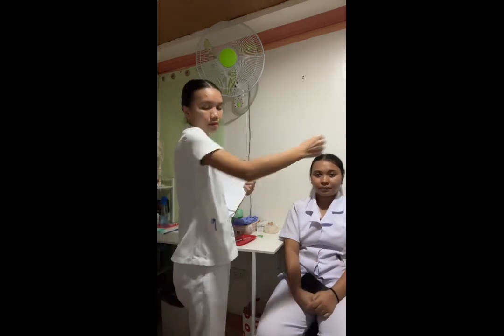Okay. So next we are going to provide for the client's privacy, to provide a secure environment for the client and also maintain her dignity. So let me just pin the curtain around the patient. And then we have to select and cleanse the site. Select a site, for example the forearm about a hand's width above the wrist and 3 or 4 fingers' width below the antecubital space. Selecting the correct site allows for accurate reading of the test site at the appropriate time.